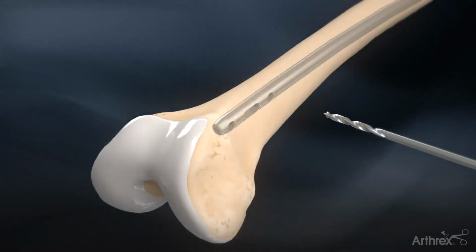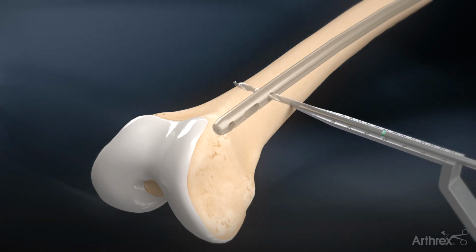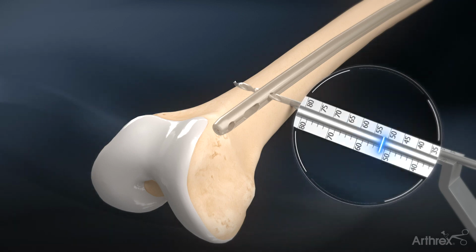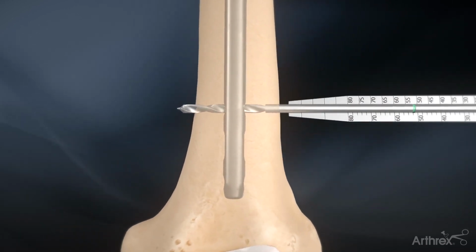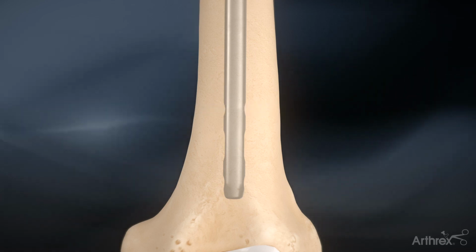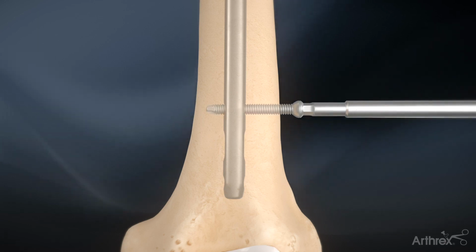Using a perfect circle technique, drill bicortically through the distal femur with the short 4 mm drill bit. Measure the screw length using the green line on the drill bit referenced off the distal depth gauge. Insert a distal 5 mm cortical screw using the hex driver to complete the nail fixation.